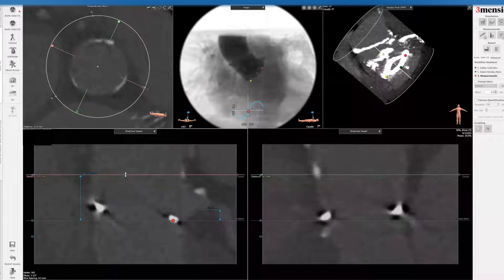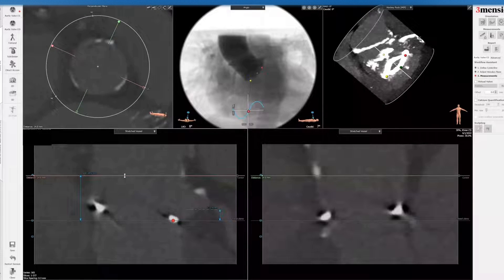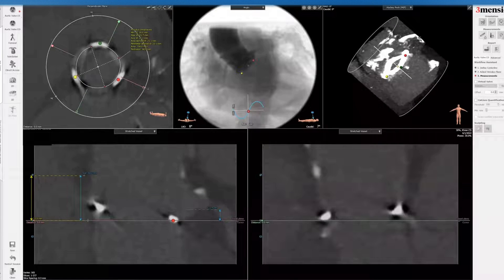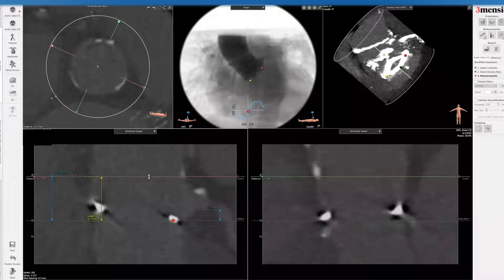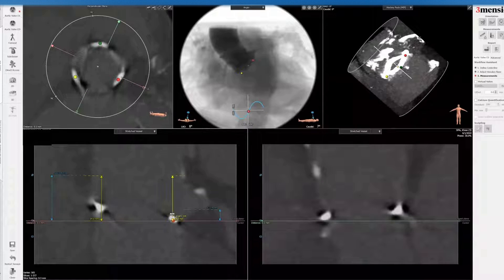Here's where the difficulty lies — determining the height of the surgical valve. We typically go by what the valve-in-valve app shows, but I also look at the CT to see where the leaflets disappear. In this case, I'll stop at approximately 14 millimeters, then go down to the base using right-click and custom link measurement. I'm drawing a virtual box showing what the leaflet looks like when it pins open and becomes a tube shape with this surgical valve after valve-in-valve. The inner diameter will be smaller because it's a 21 Mitroflow, but if we're putting in a 20 millimeter prosthesis, that's going to be the waist.